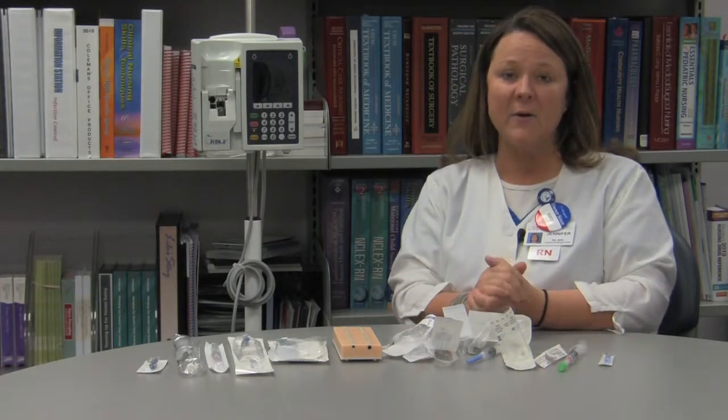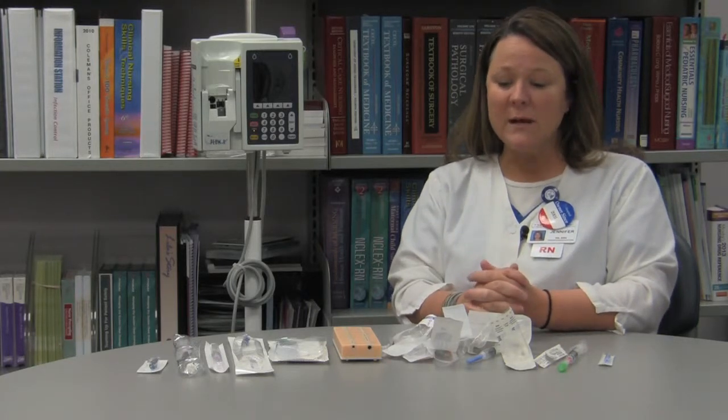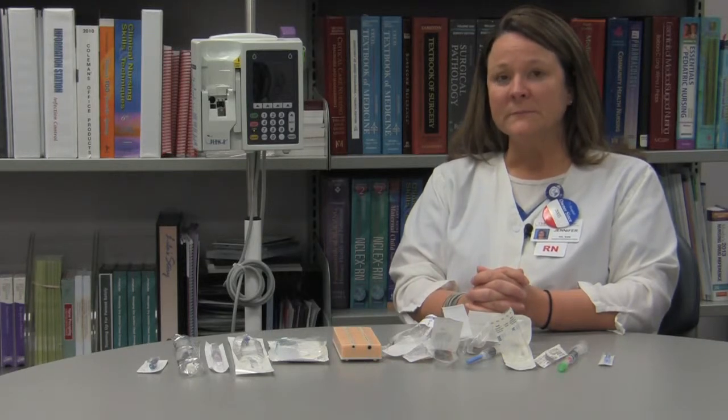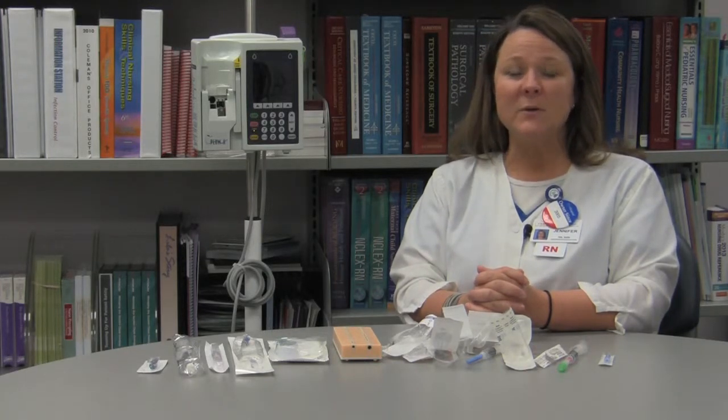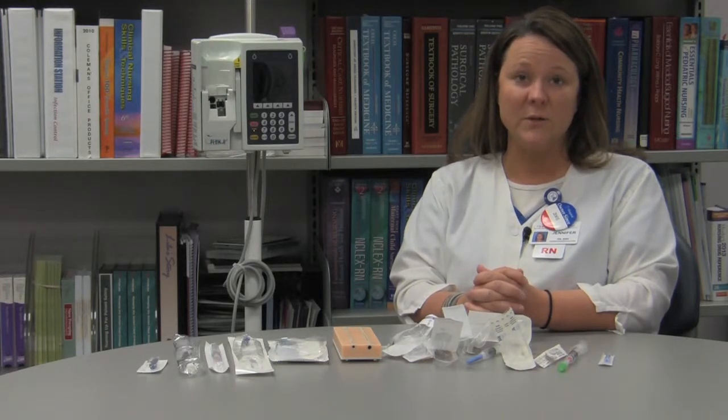That is a good safety feature that we have with our IV tubing, is that it is syringe to port. You would never want to puncture one of the ports in your IV tubing with any type of needle, be it blunt or sharp. Just remember, anytime you're giving a medication or injection, to use whatever safety device is available to you.